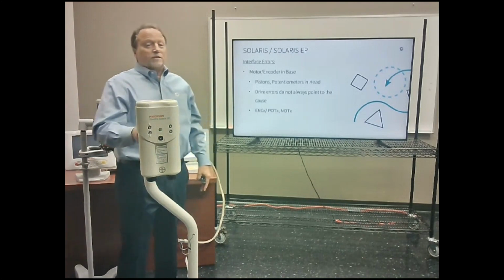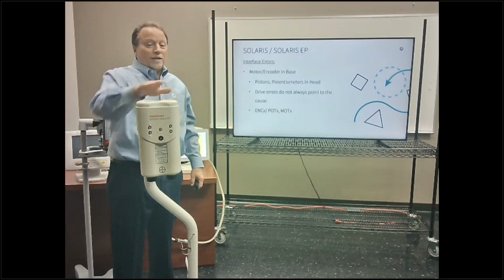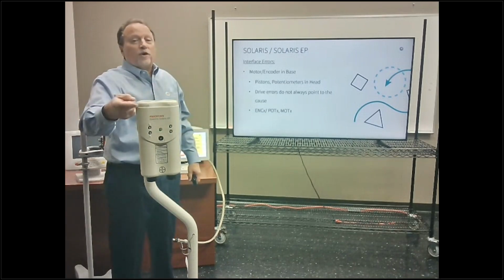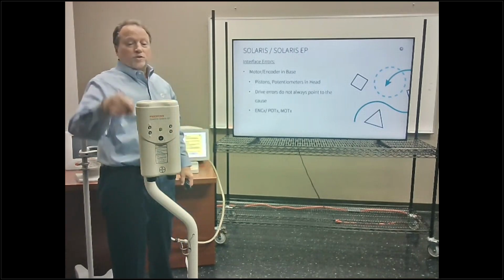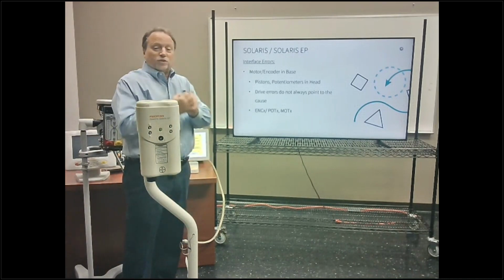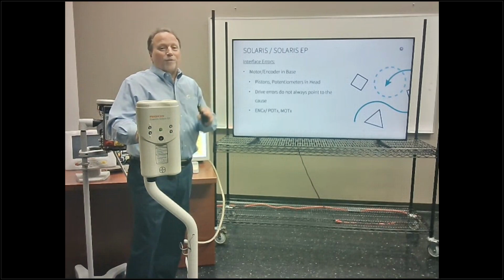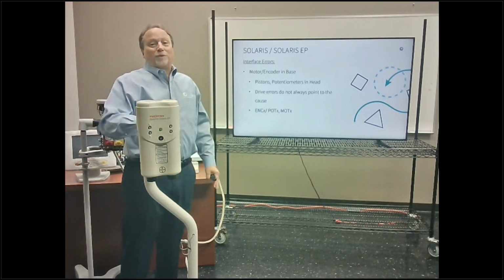So just because it says syringe error doesn't mean the syringe interface is bad. It is anywhere in that communication circuit. That goes for the potentiometer, and also the pressures. Everything runs through the head cable, which is a bunch of wires all wound together. The newer MR Experion has done away with that. They use fiber optics from the head to the base. So that's going to be a lot easier to troubleshoot.